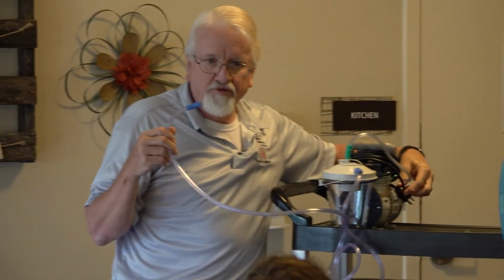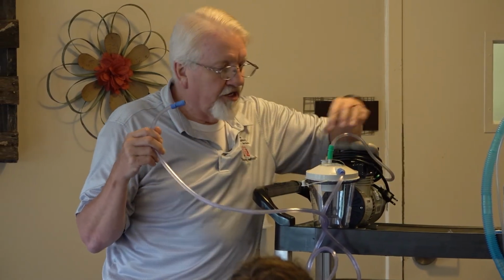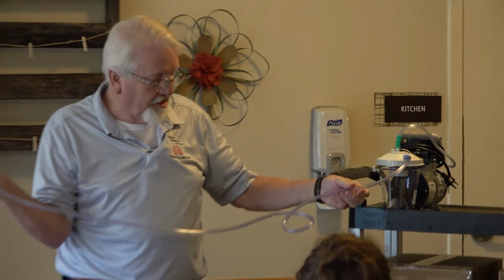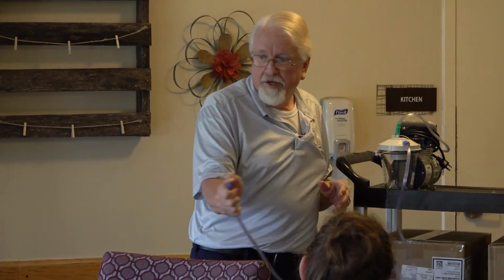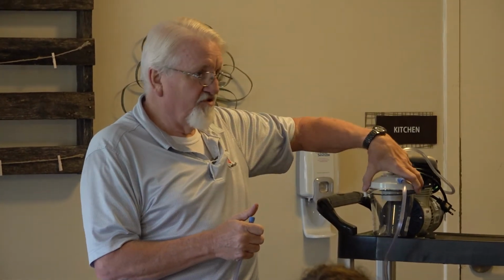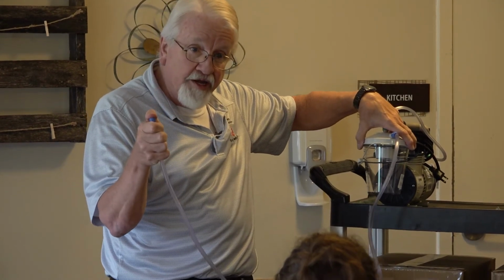The next thing I'm going to do, visually, is look over and make sure my two tubes are hooked up. One for the actual suction, and then this one here for the tube that we're going to use on the patient. I'll just make sure I've got some suction.